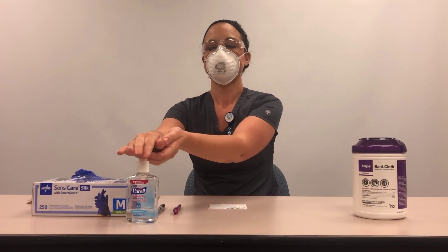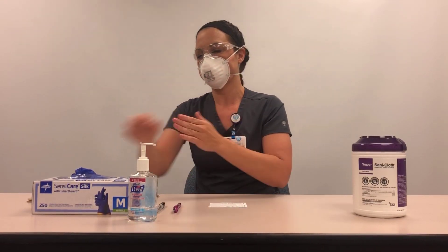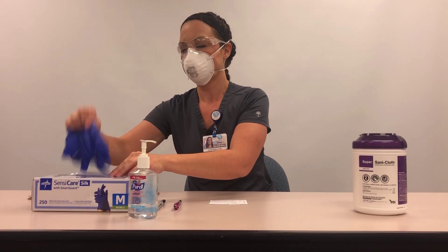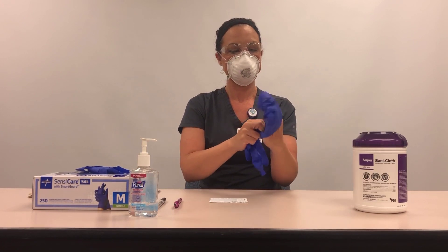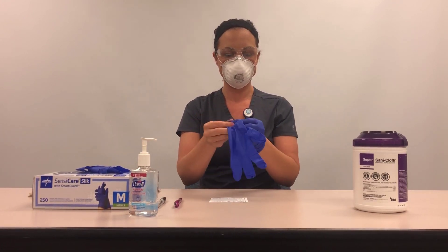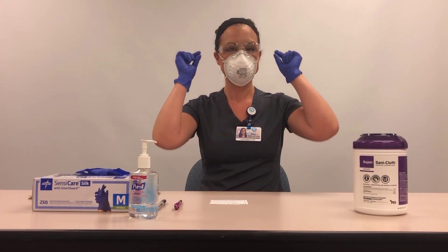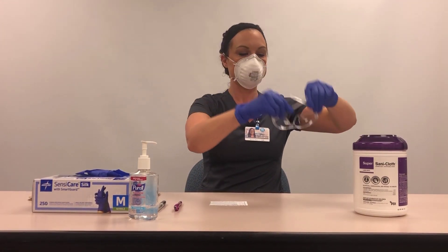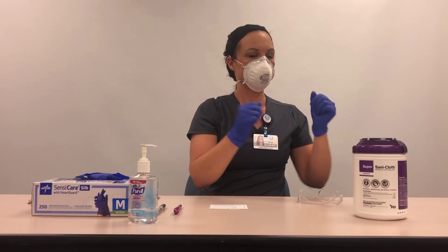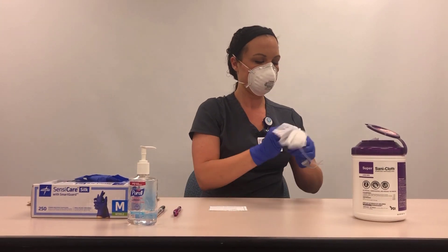Outside the patient room, perform hand hygiene and don clean gloves. Remove your goggles by grasping both ear pieces and carefully pulling straight away from your face and place on a clean surface. Disinfect the goggles and the surface where they were placed with a germicidal wipe.